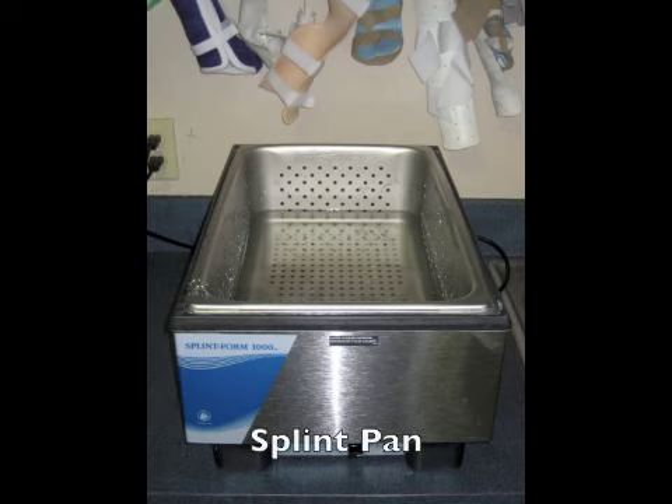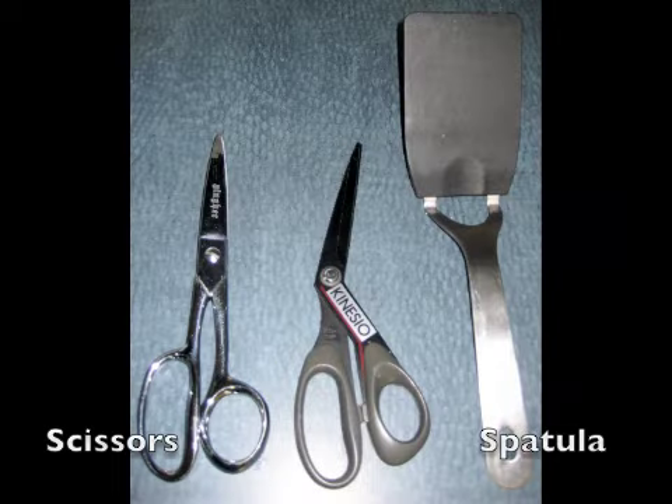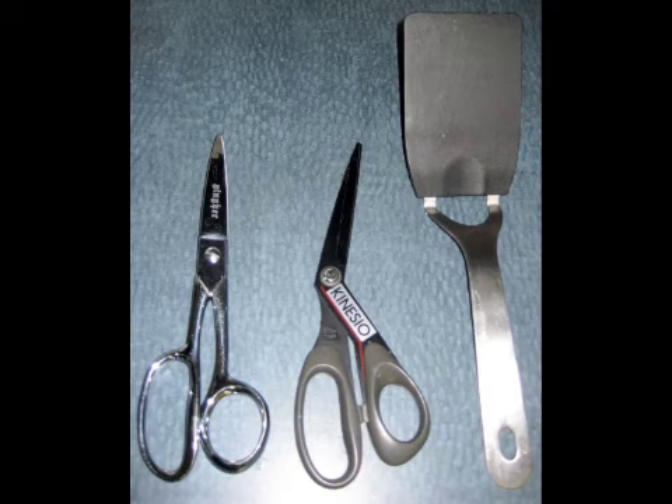A splint pan holds hot water to be used for heating the thermoplastic material. Scissors are used to cut patterns and material, and a spatula is needed to safely lift hot thermoplastic material from the splint pan.